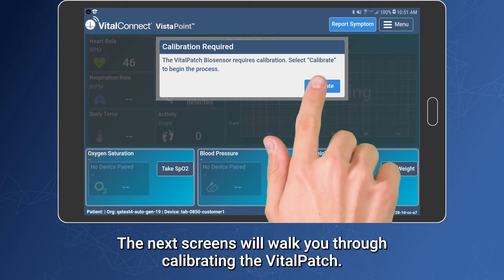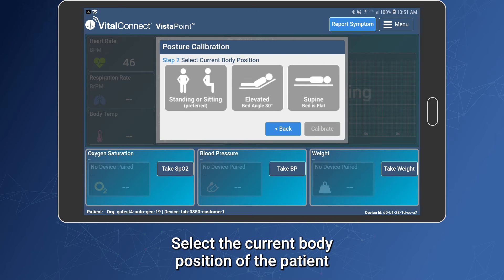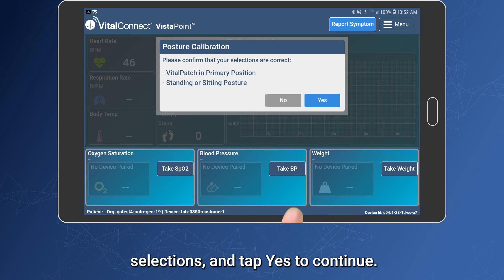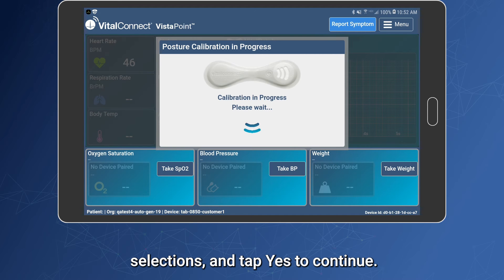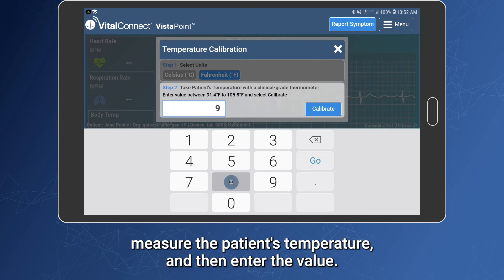The next screens will walk you through calibrating the Vitalpatch. Select the position of the patch and then tap Next. Select the current body position of the patient and then tap Calibrate. Confirm the calibration selections and tap Yes to continue. If the Vista tablet asks you to calibrate body temperature, measure the patient's temperature and then enter the value.